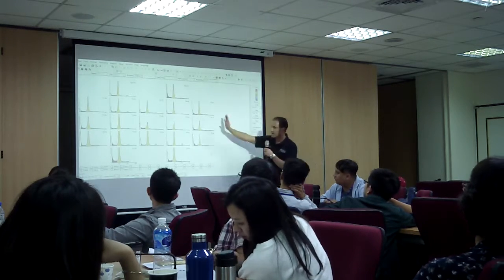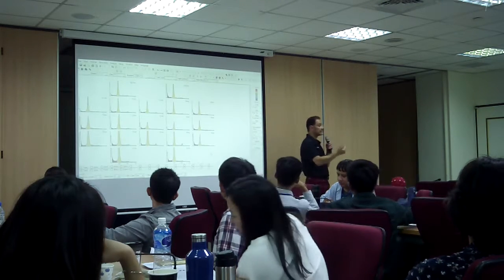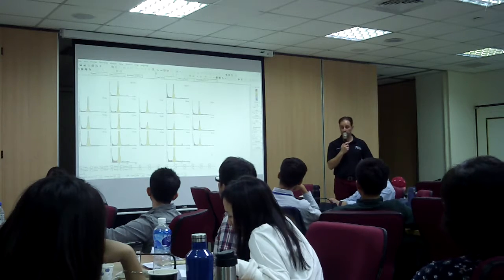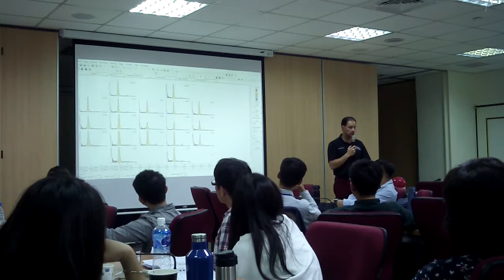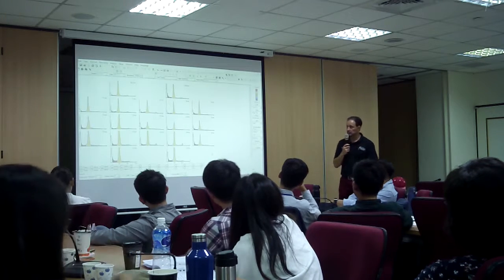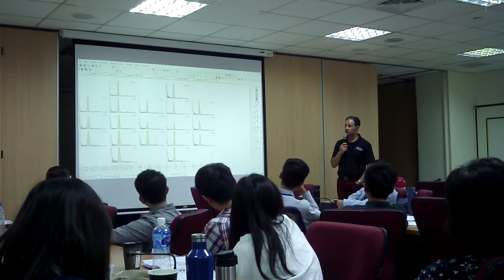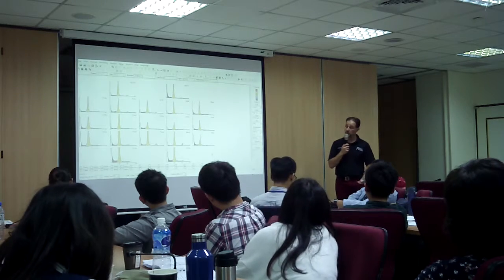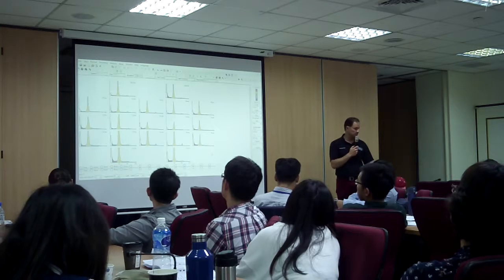Forget this, you already have that in the EEG. What else do we need to look at to decide? Who do we talk to to make a decision? The client, right? So he will tell us, I don't know, my memory or my language. So if he says memory and language, where do we train? T3, F7, T5, right?